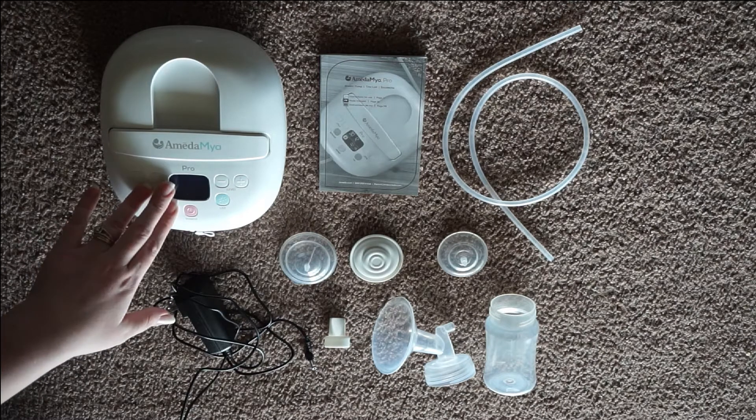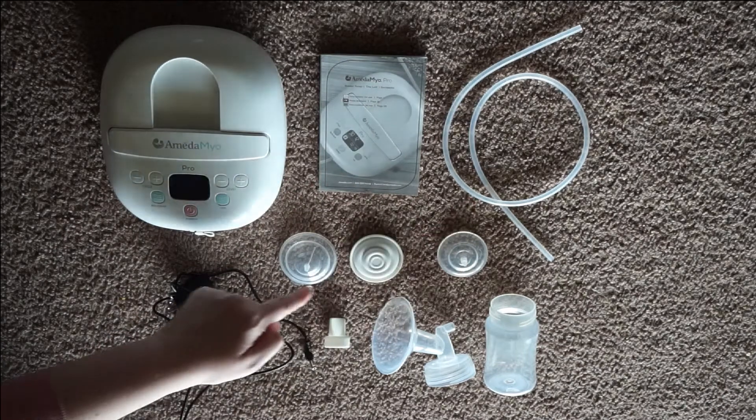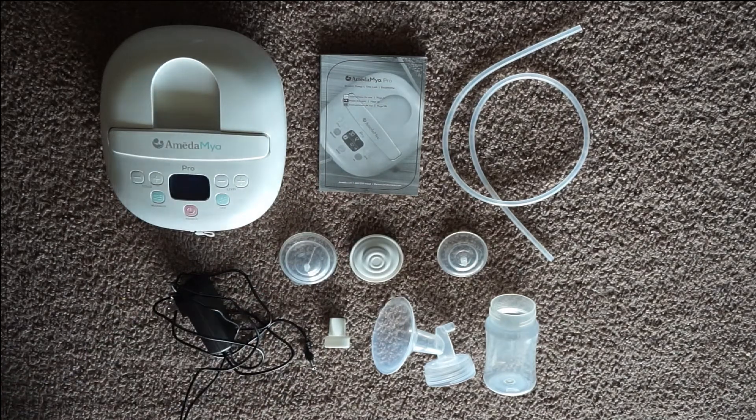First things first, we have the pump motor, the manual, tubing, your backflow protector that's unassembled, the bottle, the flange and connector all in one piece, the membrane, and then your wall adapter right here.